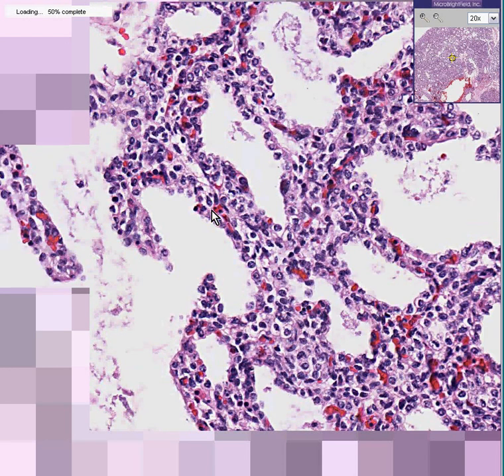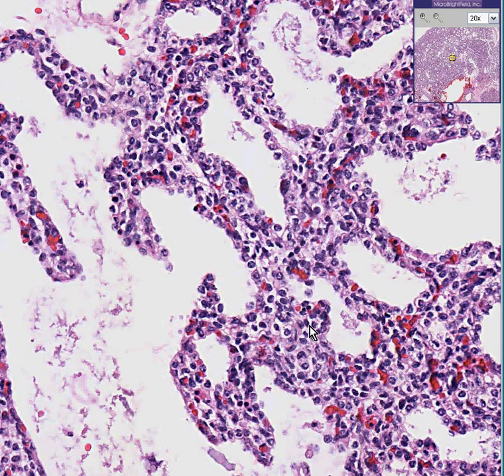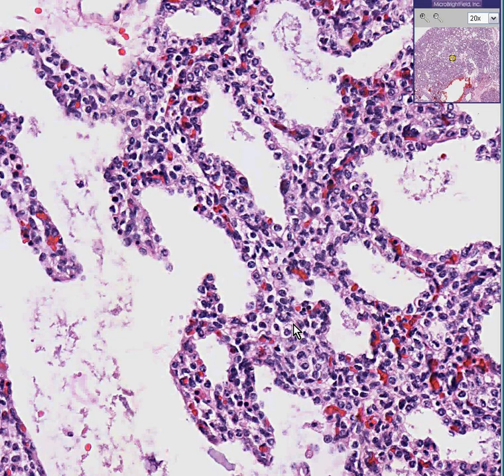Take a look and note that these septae look like they're almost as thick as the actual alveoli. Normally they should be much, much thinner. There are a whole bunch of inflammatory cells here — they look chiefly mononuclear, perhaps lymphocytes and macrophages. If you find an occasional neutrophil, you would say it's not purely lymphocytic. This is interstitial pneumonia, just a morphologic standard, and not meant to imply that it's caused by any one type of organism. Thank you very much.